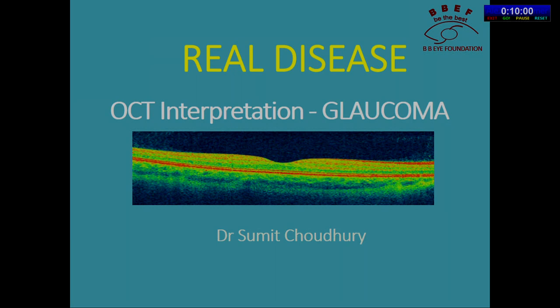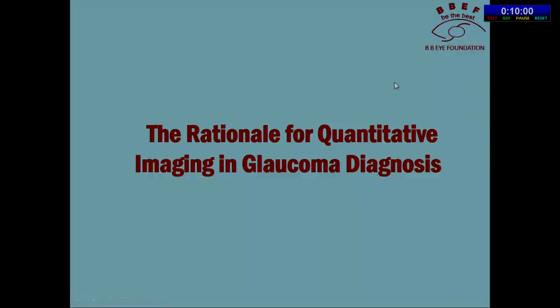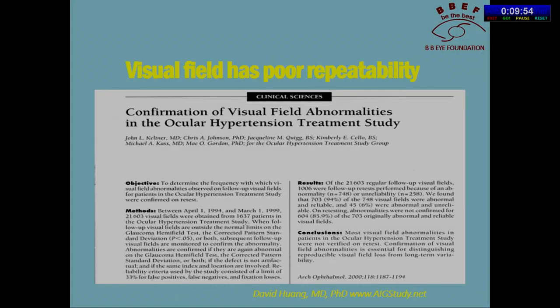This is a real disease, the OCT interpretation. The rationale of the quantitative imaging in glaucoma diagnosis. The visual field, we all know that. But visual field has poor repeatability.